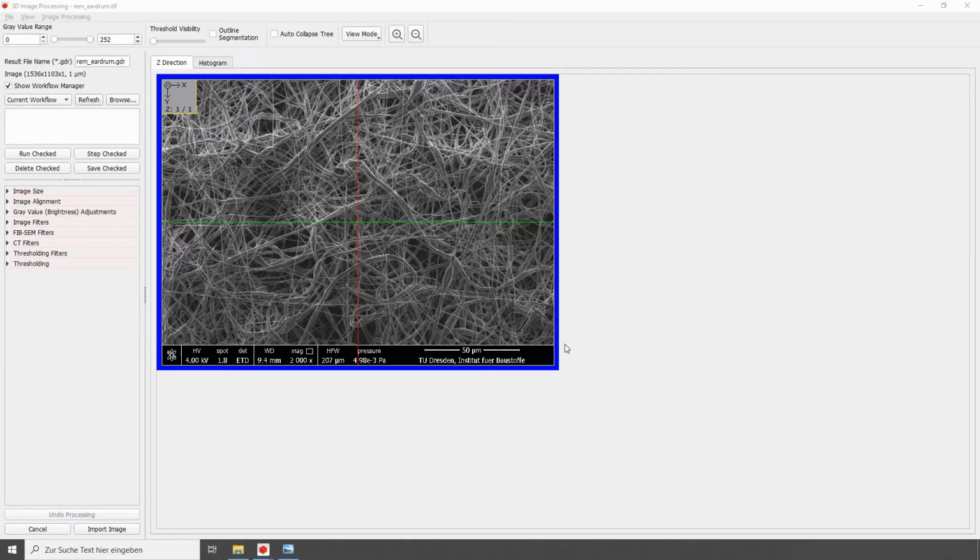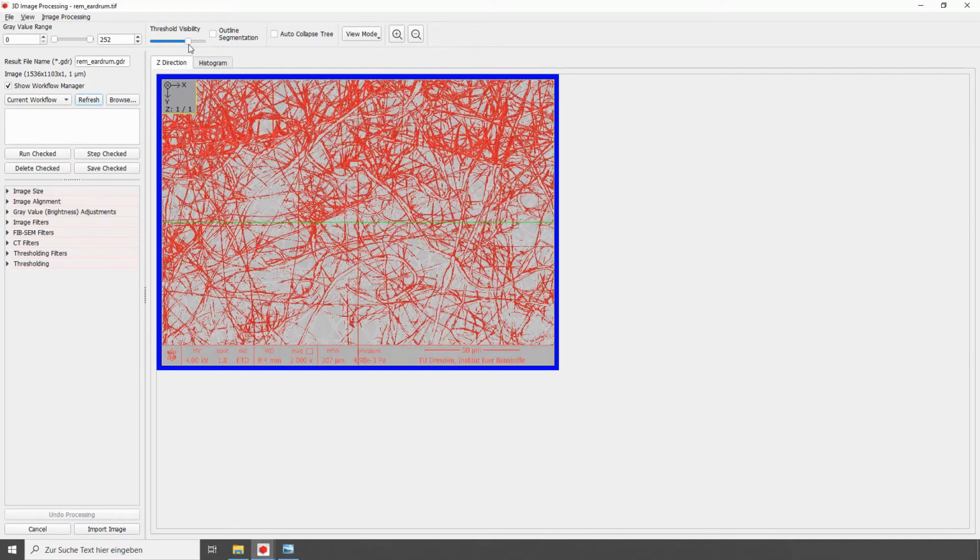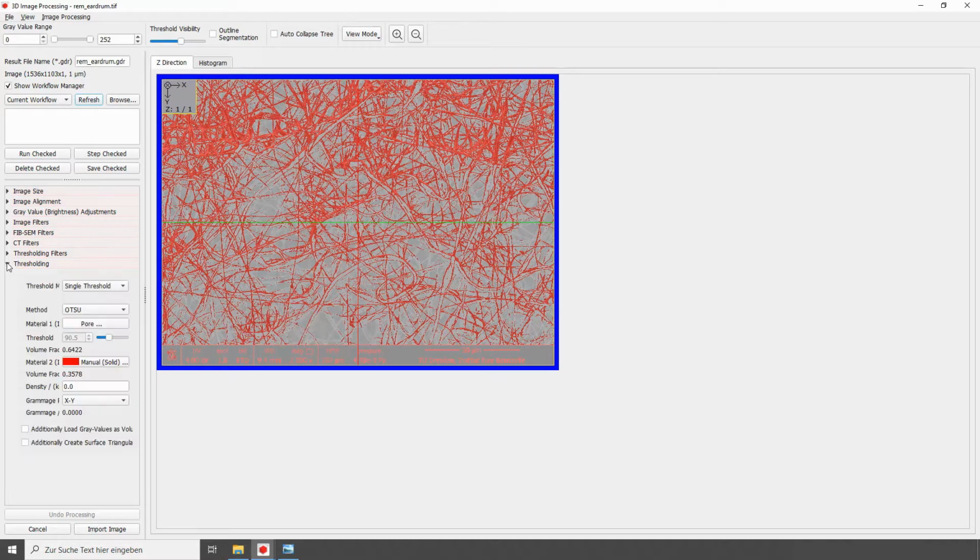To better determine the orientation of the fibers, later on we have to segment this image with GeoDict. Since it is a SEM image, it is not easy to segment the fibers. On the one hand, there is a gradient in the depth of the image, and on the other hand, there is only one 2D slice on which we can work. This becomes particularly clear when the current segmentation is varied and made visible using the currently set threshold under Threshold Visibility. That's why a little manual work is required here, and you can't just use the fully automated Otsu segmentation under thresholding.